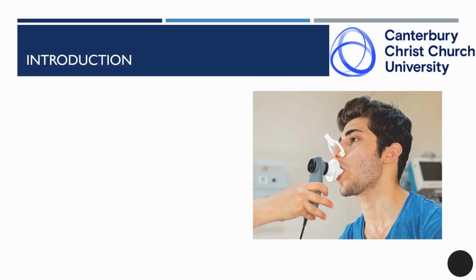Spirometry is a vital diagnostic and monitoring tool for respiratory conditions such as asthma, chronic obstructive pulmonary disease or COPD, and post-COVID lung function assessment. Key indicators like forced expiratory volume in one second and peak expiratory flow provide critical data for patient diagnosis and treatment planning.